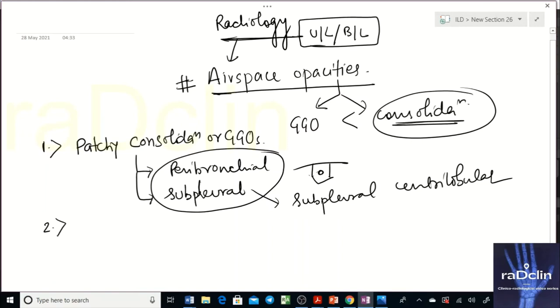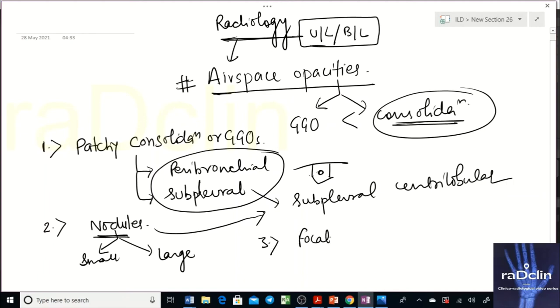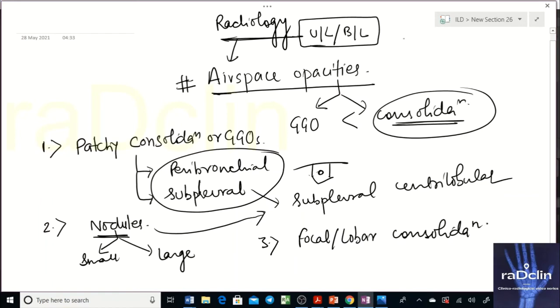A second pattern is nodules, which can also be present in the same subpleural centrilobular location. These nodules can be small or large. A third possibility is focal or lobar consolidation — that is another pattern to remember.